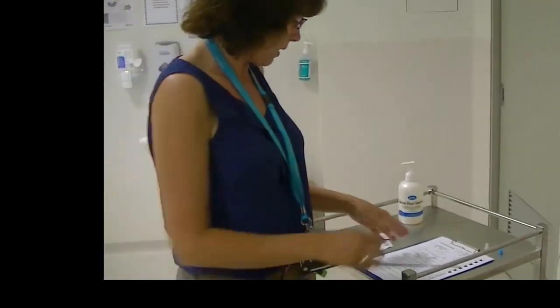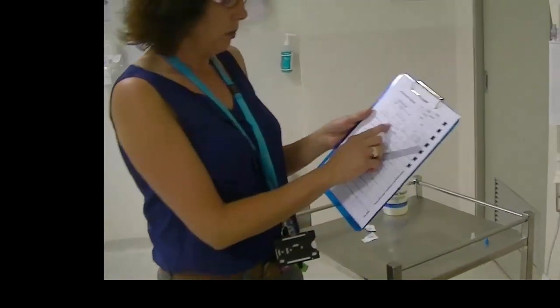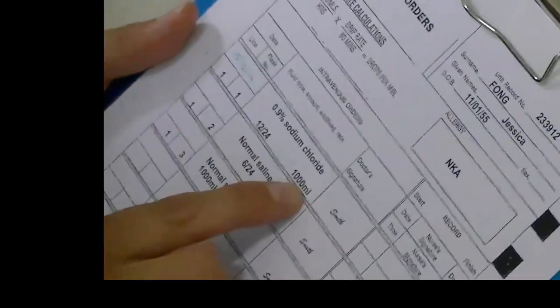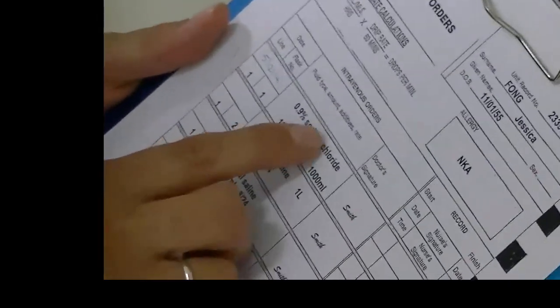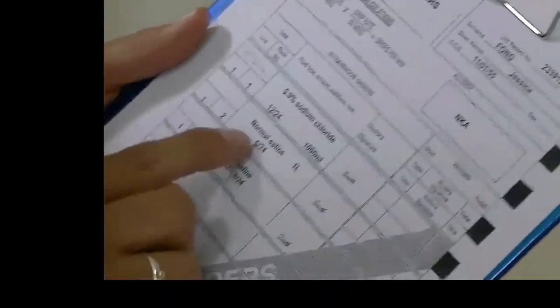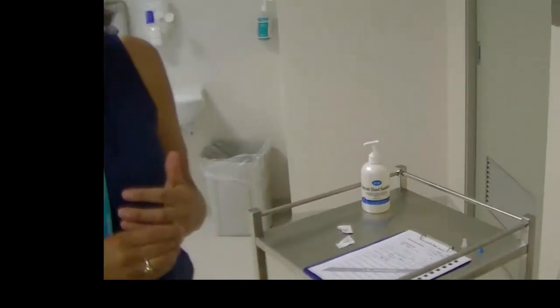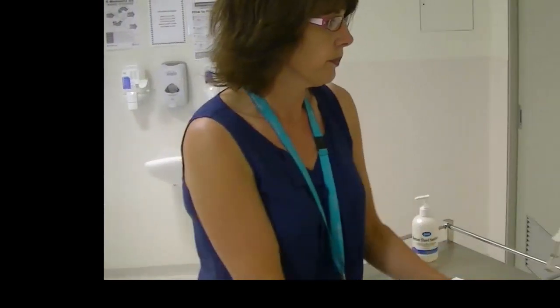Okay, now I've done a calculation. I've got 0.9% sodium chloride for 12 hours, so it's 1,000 mils divided by 12 times 20, because it's a 20 drop per mil drip chamber, over 60. So 1,000 divided by 12 times 20 over 60. So I know that it'll be dripping at 28 drops per minute. So I will start. Here we go.